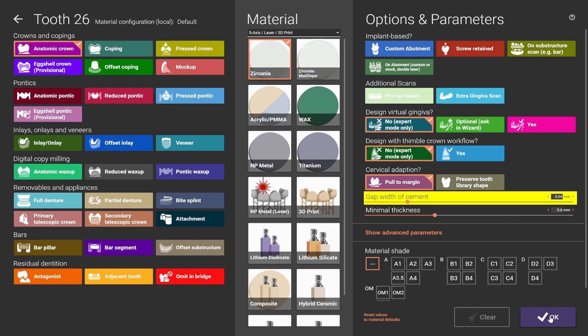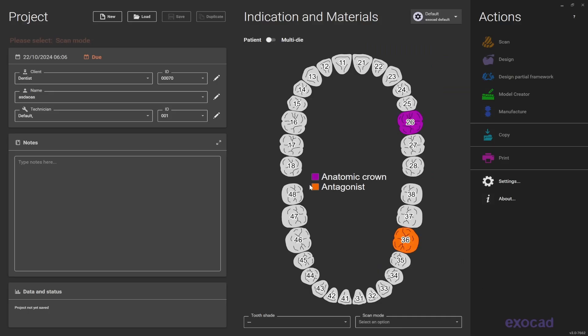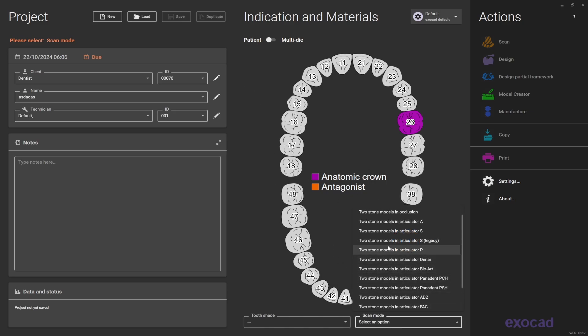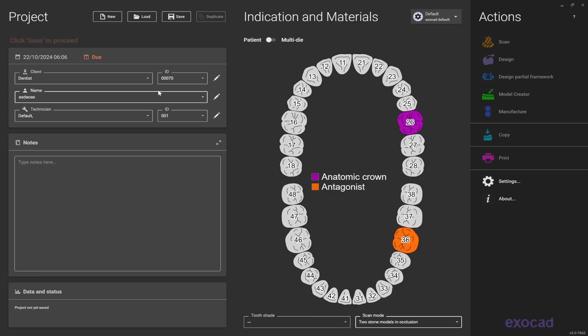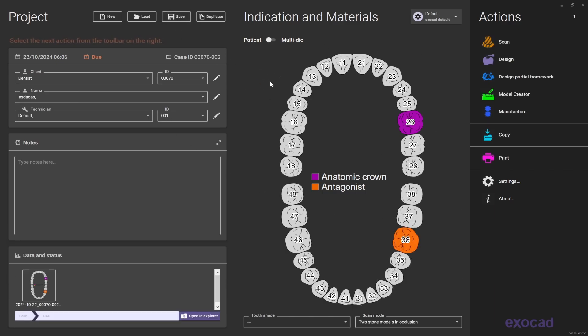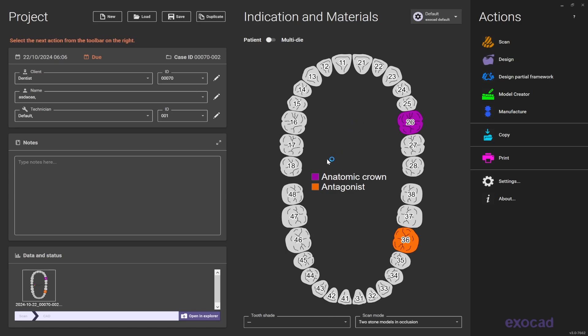If you are happy with it, press OK. Because in this case we have the working model and an antagonist, you come here on the scan mode and select two models in occlusion, and save the project and select design.